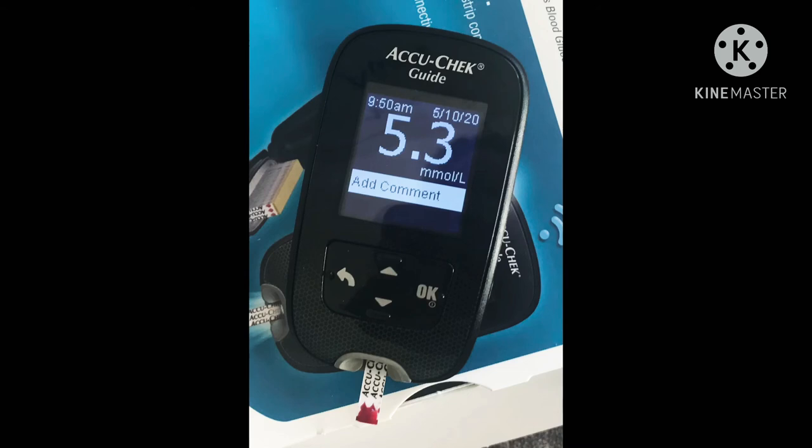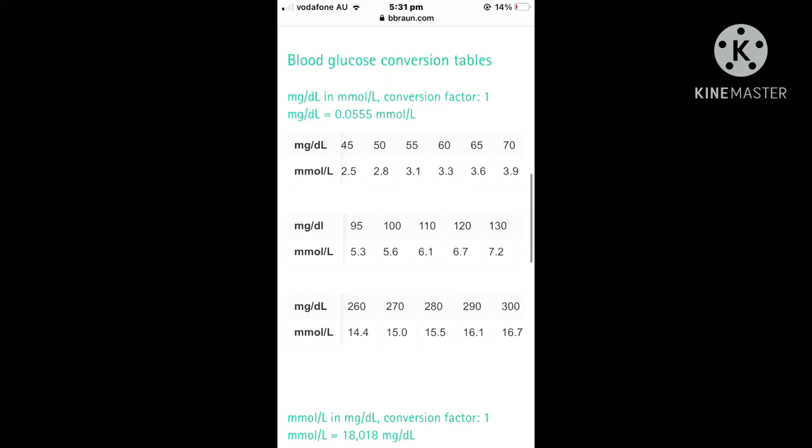Here are the results I actually got for all three ferrets — their glucose was really good. As you can see the test strip is in there with the droplet of blood, which is about the amount you need, and they got 5.3 MMOL. Looking at the chart, the range is 3.6 to 6.1 MMOL, so 5.3 is dead smack in the middle — or in MG terms, that's within the 65 to 113 range. My ferrets are healthy with no sign of insulinoma, which is great. I test them about twice a year.